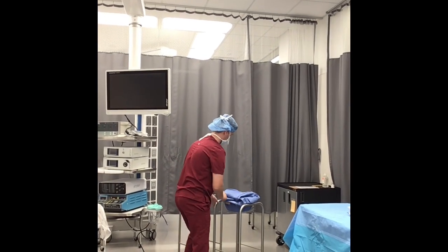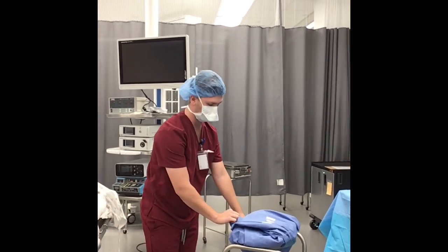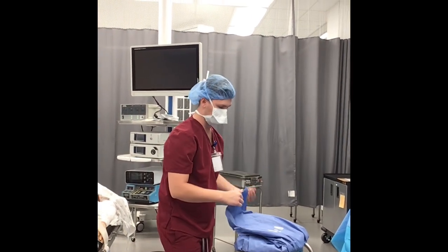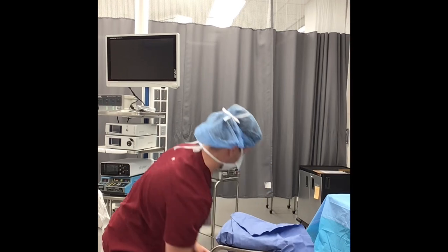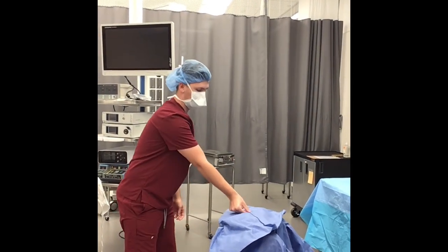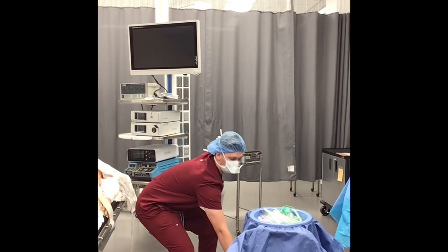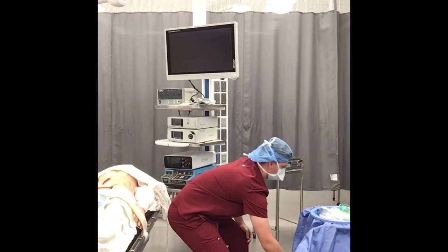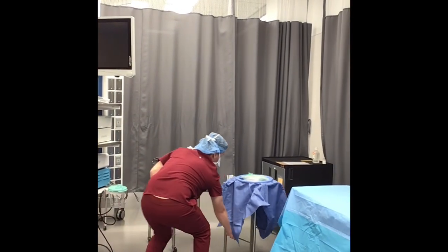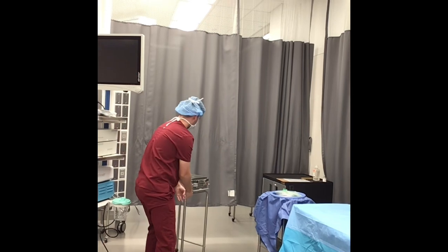So my next thing I have here is my basin. So this is the same concept as my gown. It's envelope wrap. So first flap, I'm creating space. I'm going to open up away from me, my two side flaps, and then my last flap is going to come towards me. Okay, and then to move it, I'm going to grab underneath here, below sterile level, and move that, again, 12 to 18 inches away from my back table.